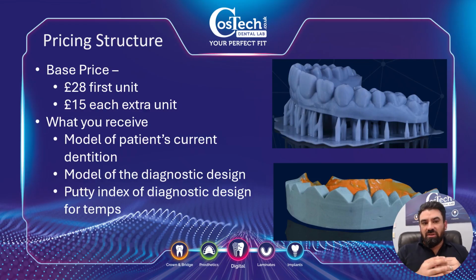Because previously when we were doing diagnostic wax ups, you would charge like £20 per unit, and so if you're doing 10 of them, it was like £200, because the amount of time the technician had to spend on each one was pretty much the same. Now we actually get the ability to work on whole arches rather than just making each individual tooth individually.